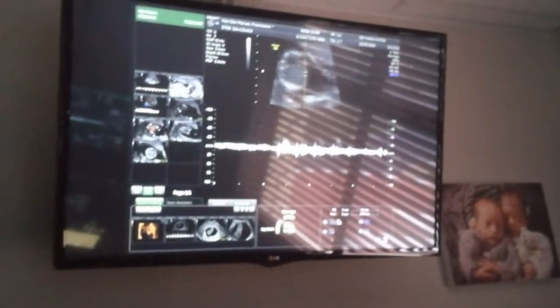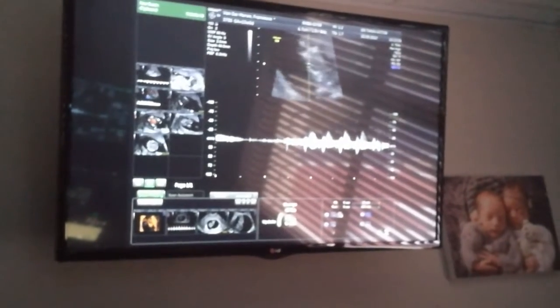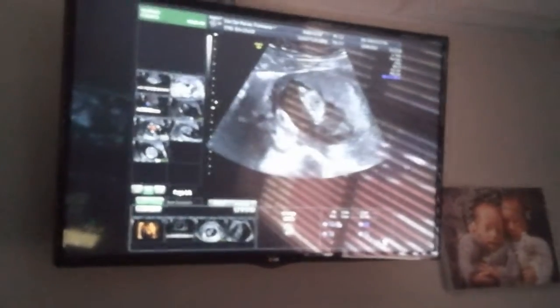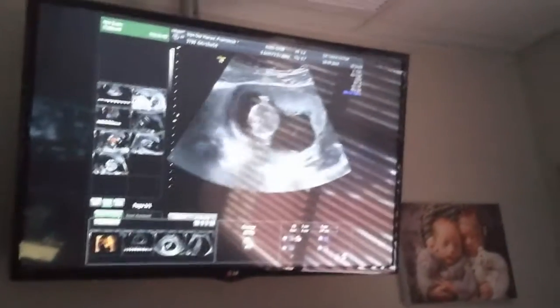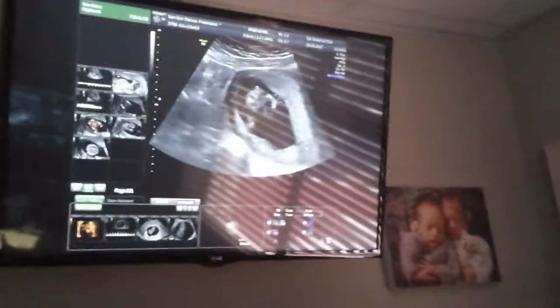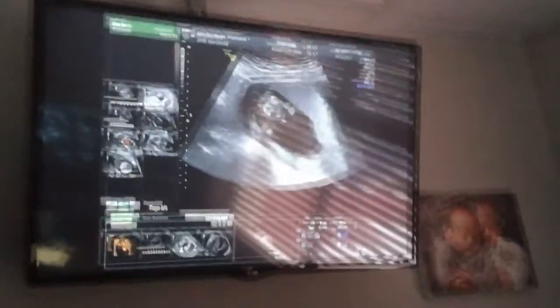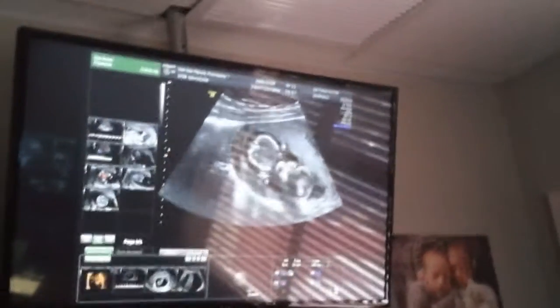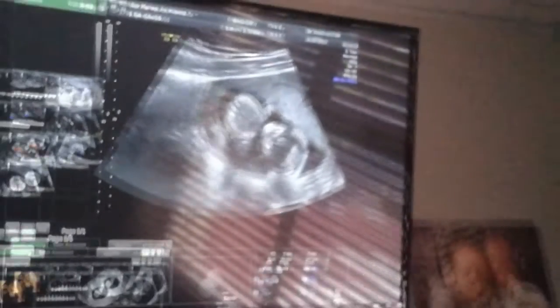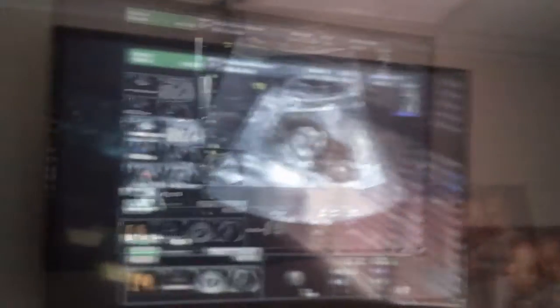You can see how she moves around here. Two arms — you can see her hand. Upper arm, there's the other upper arm, and the other arm. So far, so good.